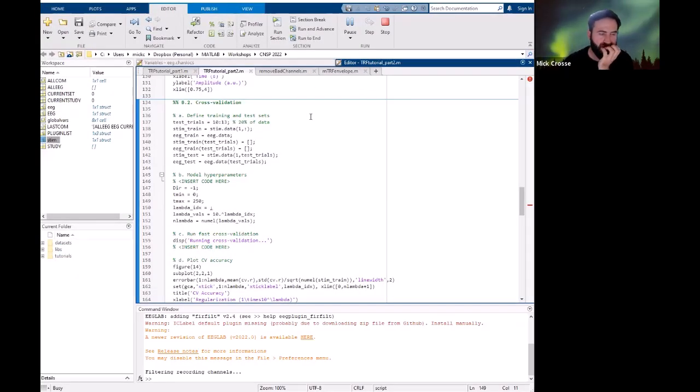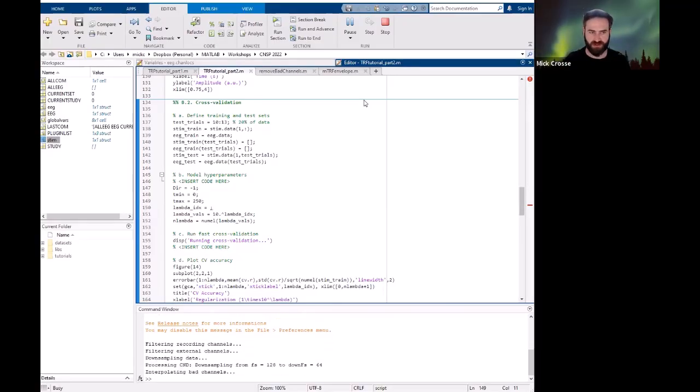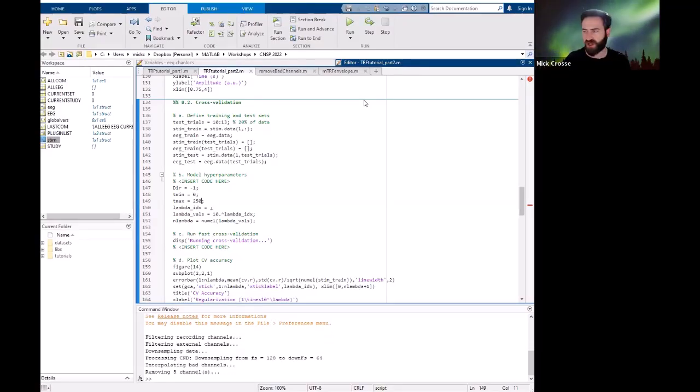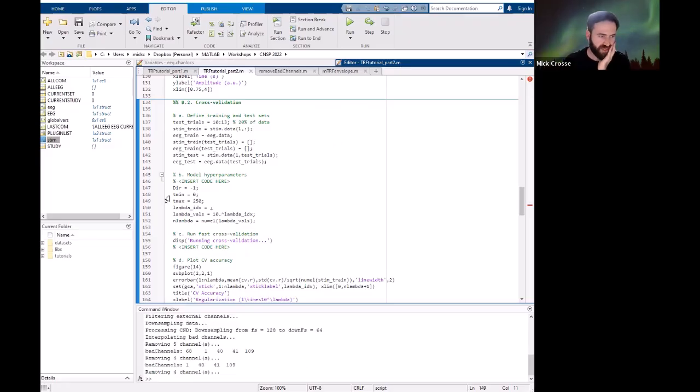Because we're mapping backwards, we have to map basically 128 channels back to the envelope. There's far more features that we have to map onto the output, so the backward analysis takes a lot longer. So I'm trying to minimize the amount of time lags that I'm using here to make it as efficient as possible without sacrificing the accuracy of the model itself.